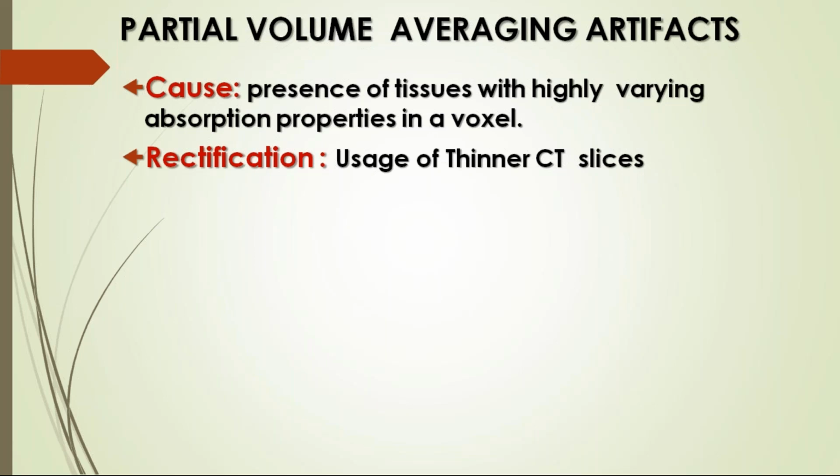If you got it, I will show you some images after that. How to rectify: use thinner CT slices.